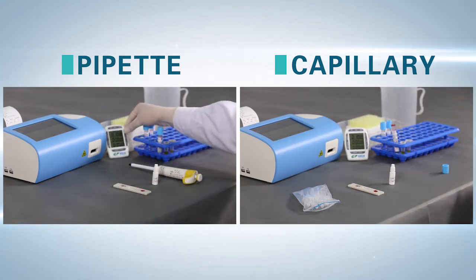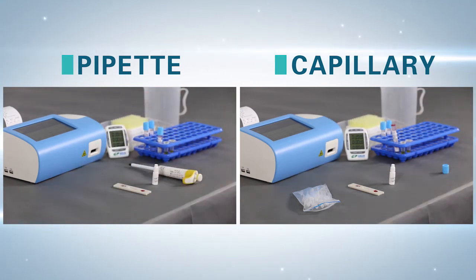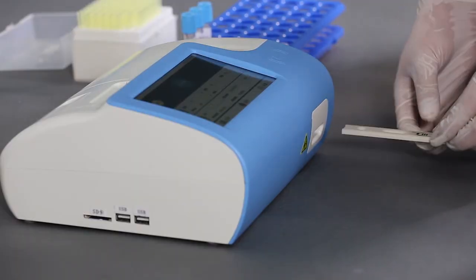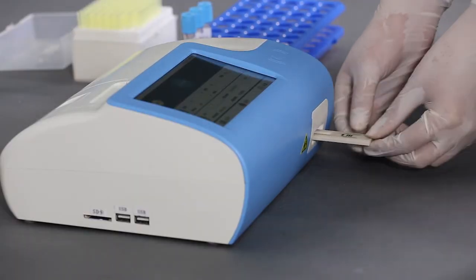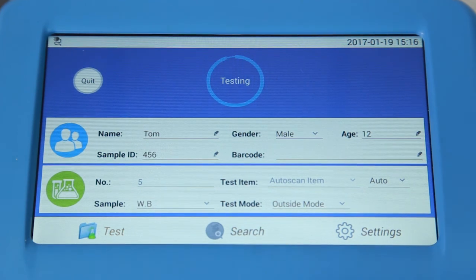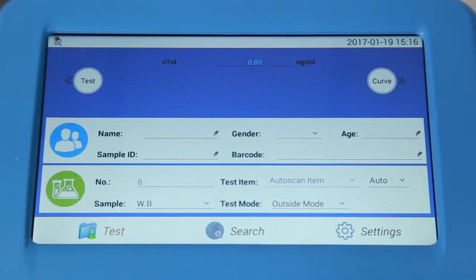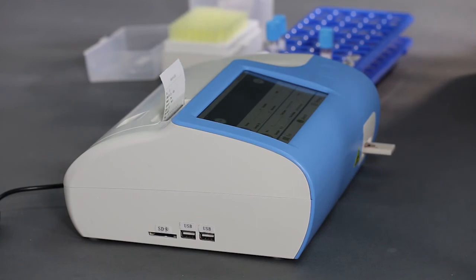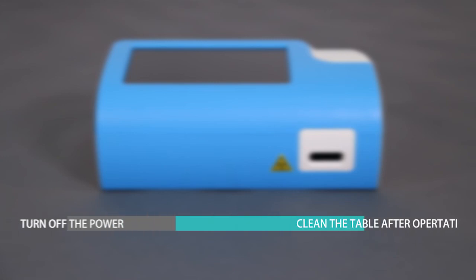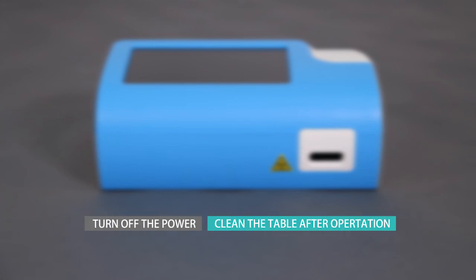Count down 10 minutes for the reaction. Step 3 – Measurement and Auto Result Printing: after the reaction, insert the sample card into the test port. Press Start or click Measure to test and print the results automatically. Turn off the power and clean the table after operation.